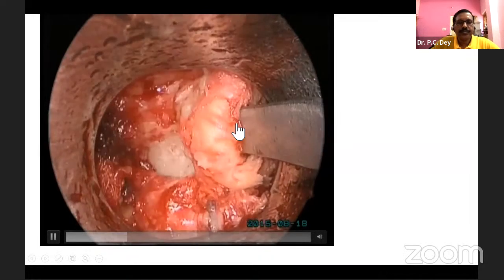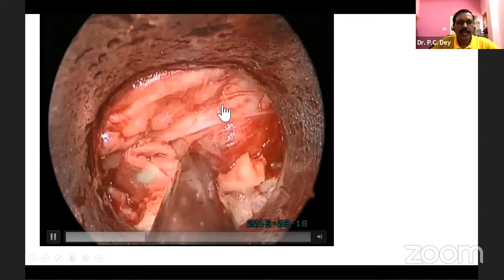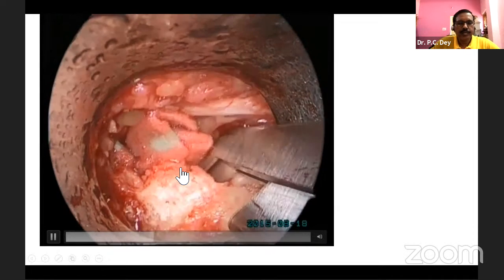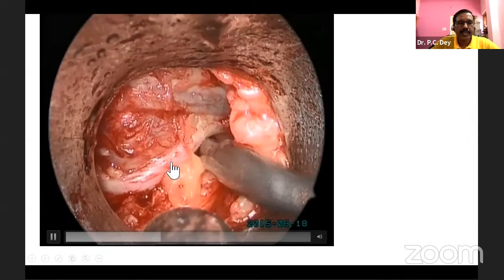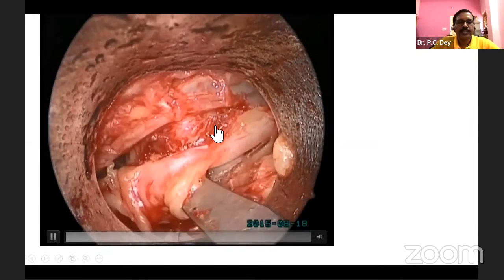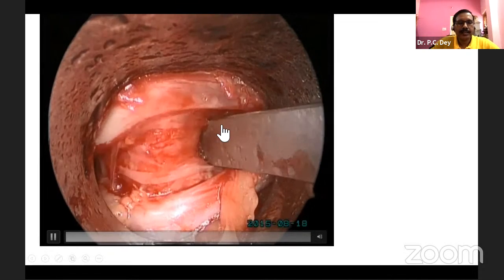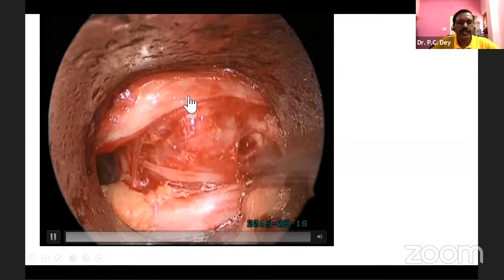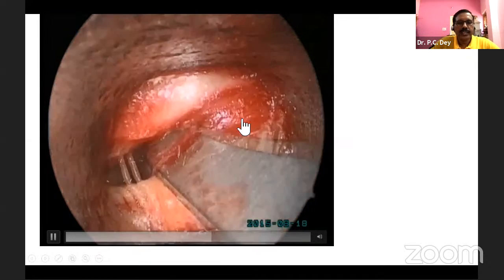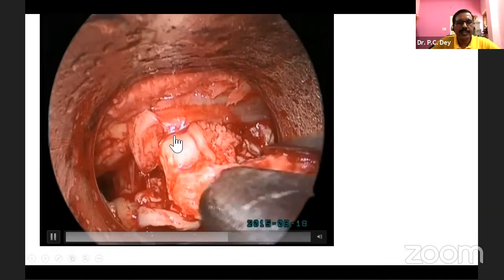So this is the superior lamina. We have detached the ligamentum flavum, and this is the hypertrophic facet. After removing the hypertrophic facet and the thickened ligamentum flavum, because the patient was 52 years old, there is a huge axillary disc. This is the nerve root and this is the dura. In between, there is a huge axillary disc. It was a little bit adherent and of a really bigger size.